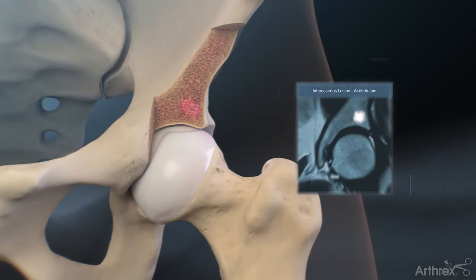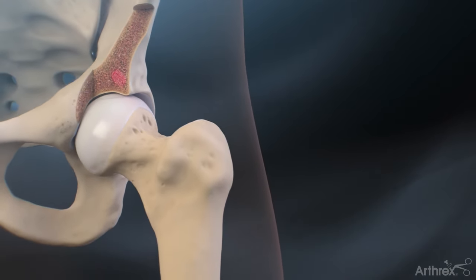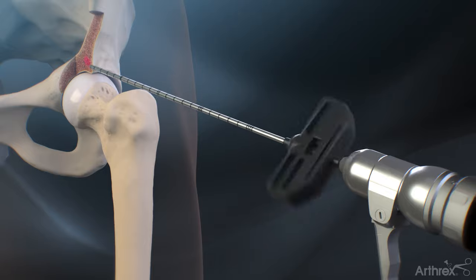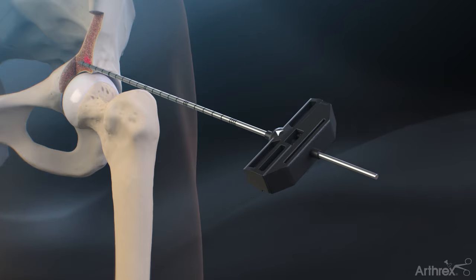The IOBP procedure may also be used to treat acetabular bone marrow lesions. When treating acetabular lesions, position the closed-tip cannula towards the lesion according to the MRI. Drive the needle into the acetabulum under fluoroscopic guidance and direct the holes of the tip towards the lesion using the white arrow on the handle for reference.